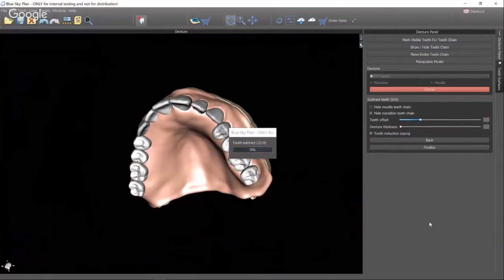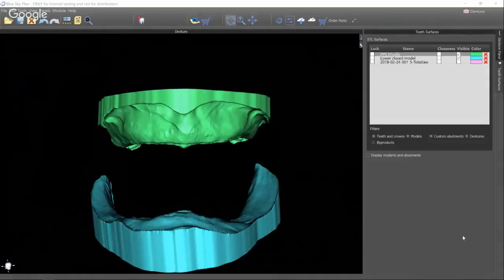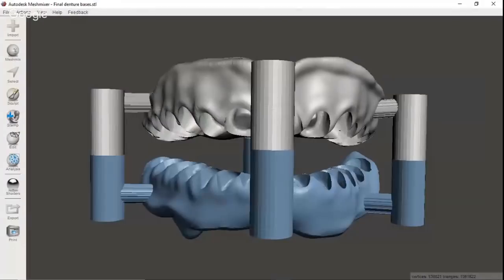Okay, so it's subtracting out the denture tooth STL from the base, which is going to leave me with a final base subtracted. Now, one of the things when you do digital dentures and you've got printed bases and you're going to bond teeth in, there is a 0.3 millimeter default spacer set between the bottom of the denture tooth and the actual base. Okay, this is the same thing as like your offset in your surgical guides.